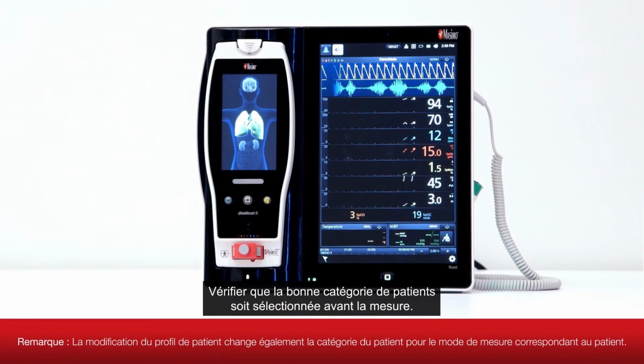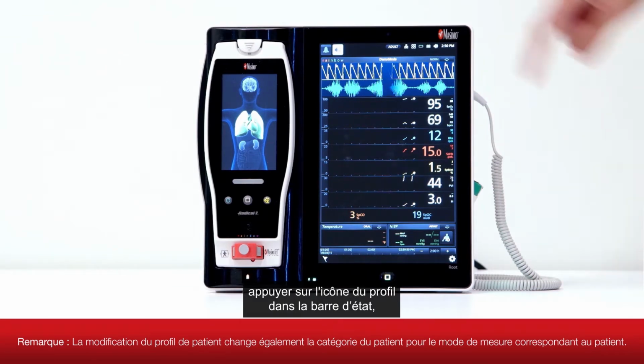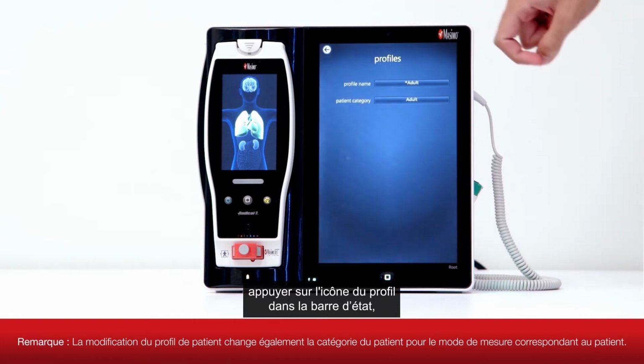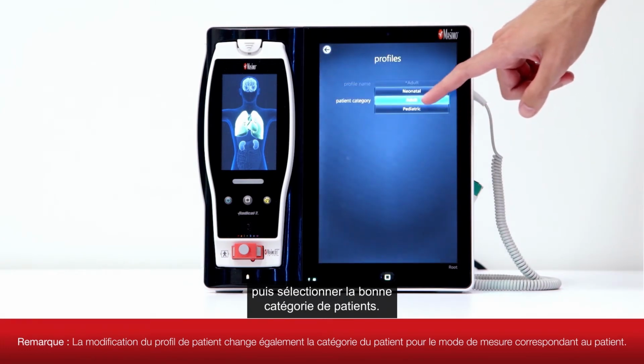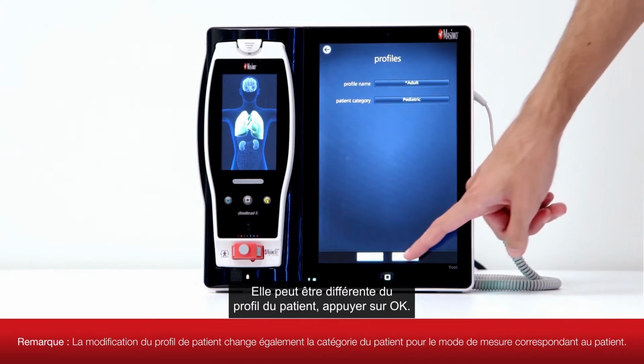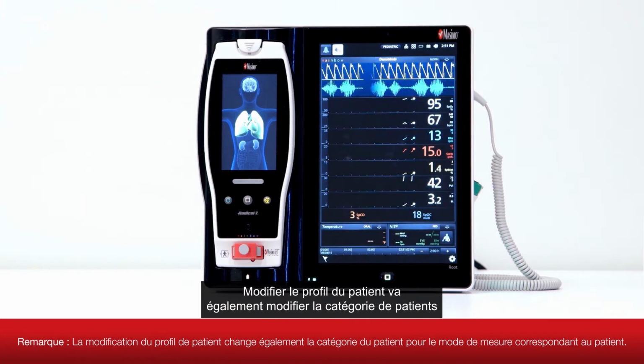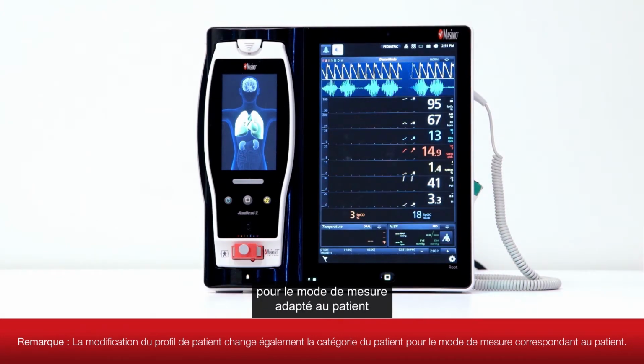Ensure the correct patient category is selected before measurement. To change the non-invasive blood pressure patient type, touch the profile icon in the status bar, then select the correct patient category. This can be different from the patient profile. Touch OK. Note: changing the patient profile will also change the patient category to the corresponding patient measurement mode.